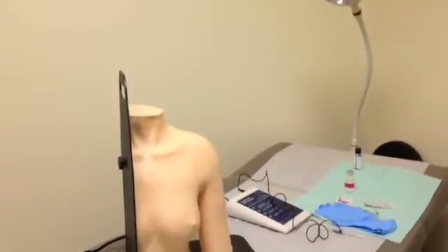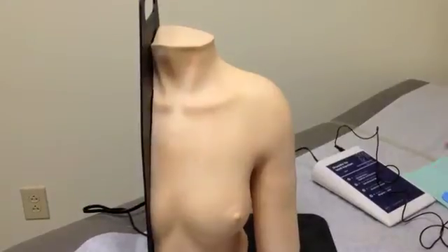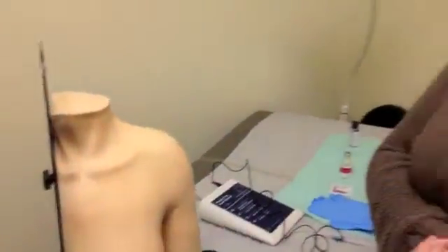Yes, I do. Okay, so can you please state which shoulder we're going to be doing the injection on today? It will be my left shoulder. Okay, so we're going to go ahead and do the anterior approach today, but first we're going to check your range of motion and make sure that you don't have any signs of infection or redness. So I'm looking over the shoulder joint and I don't see any redness, swelling, or any signs of infection that would contraindicate the procedure. So we're going to go ahead and do some range of motion.